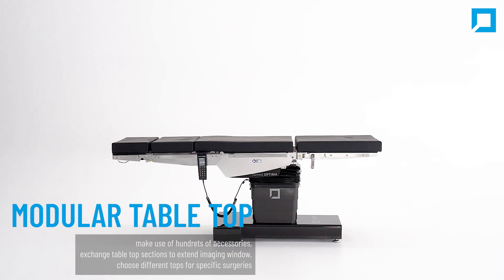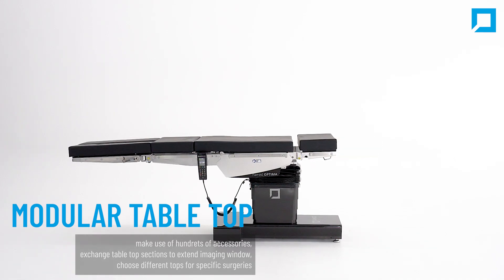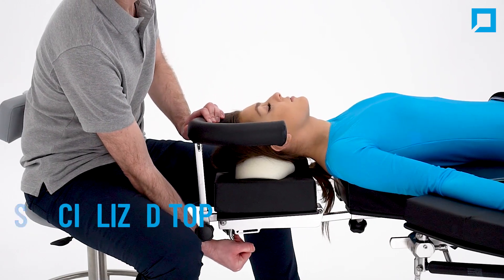Optima is equipped with a modular tabletop. You can make use of hundreds of accessories and exchange tabletop sections to extend the imaging window or choose different tops for specific surgeries.